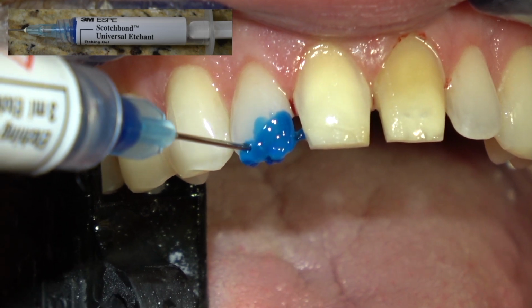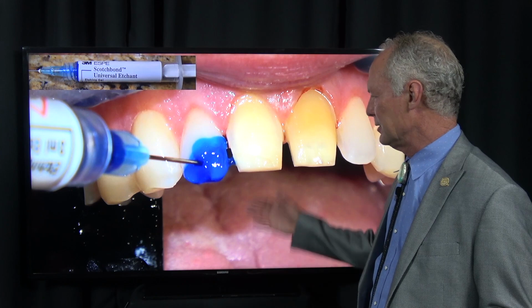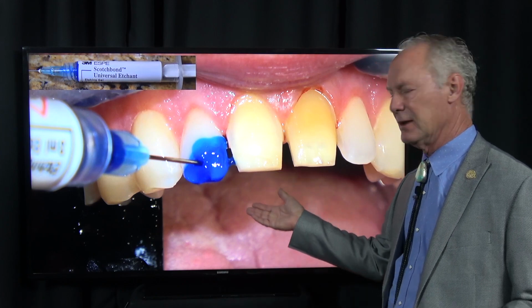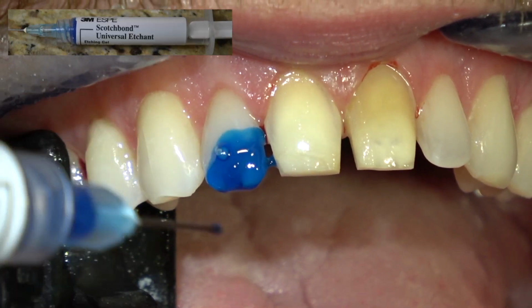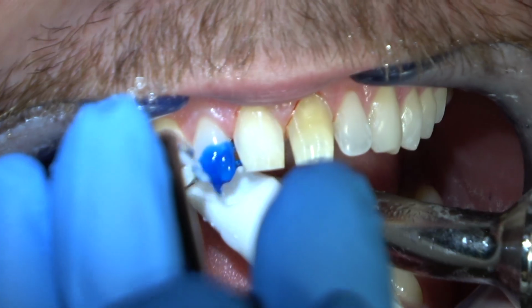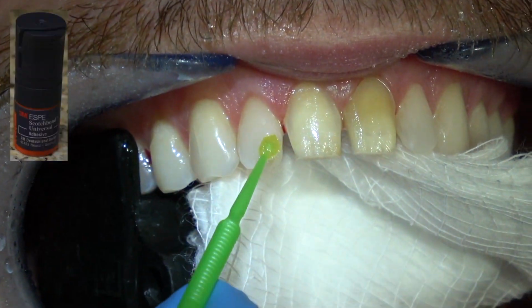Since the preparation is completely in enamel, we can etch for a minute with no problem. If part of the preparation was in dentin, then you'd etch the enamel for 45 seconds to a minute and the dentin for 15 seconds. How do you do that? You place it on the enamel first and leave it for 45 seconds, and then come back and place it on the dentin for 15 seconds. Then I'm going to rinse it thoroughly for about 15-20 seconds.